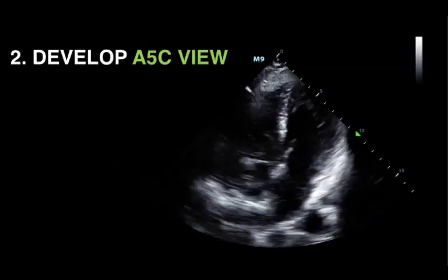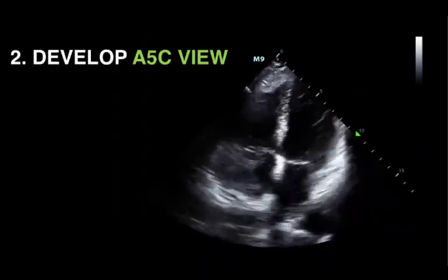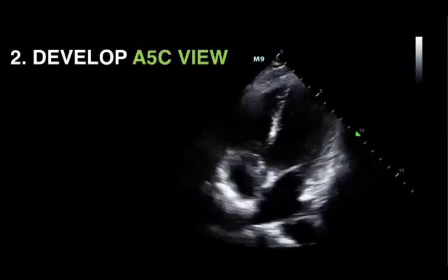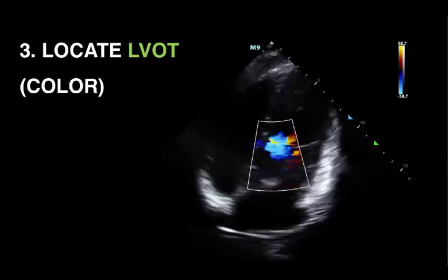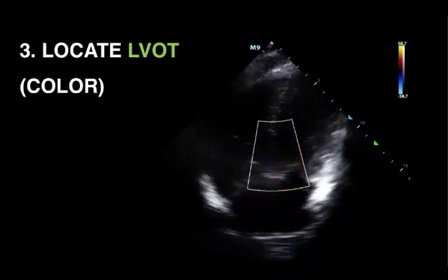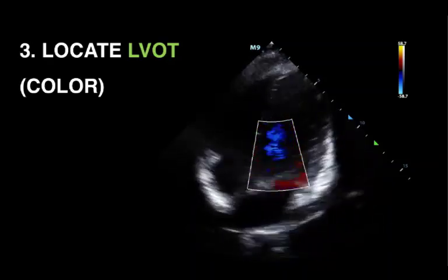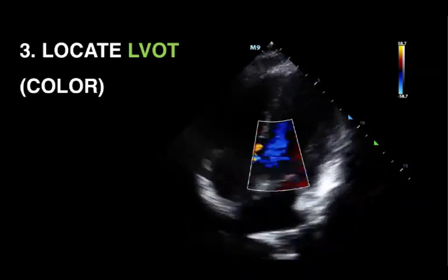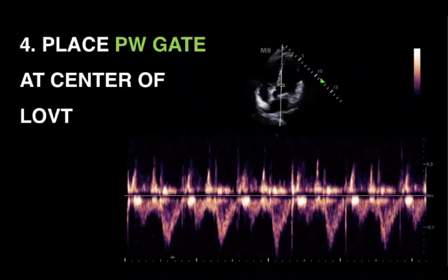You're going to get your 4-chamber view, you're going to tilt your probe, and you're going to get that 5-chamber view. You're going to bring into the picture that LVOT. Once you do that, you're going to add color. And I like to do this so that I know where the jet is. You're going to simply put your color, put the gate right over the LVOT, and it's that blue sausage there. That is our LVOT, basically a column of blood. And you're going to place your gate right in the middle of that column, at the center of the LVOT.